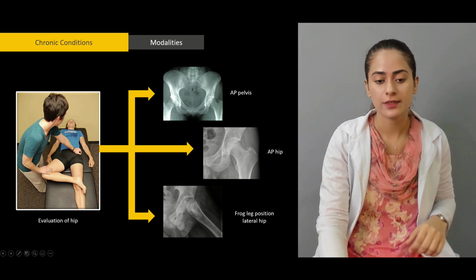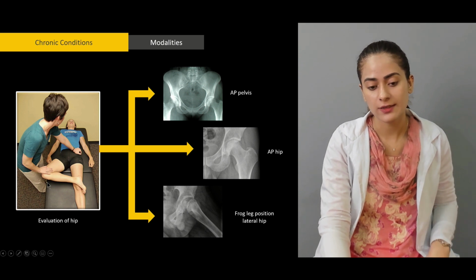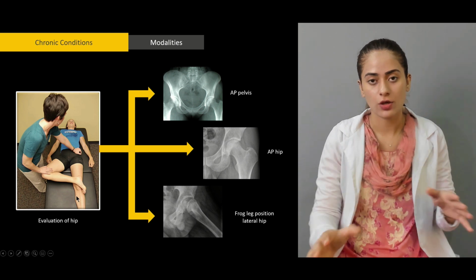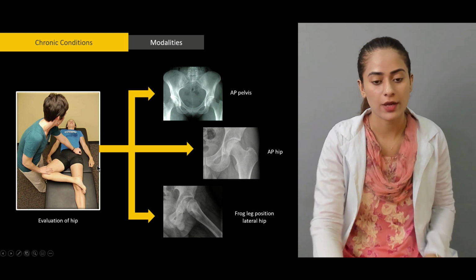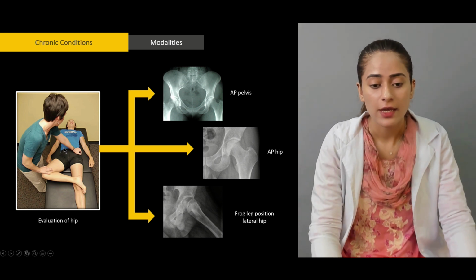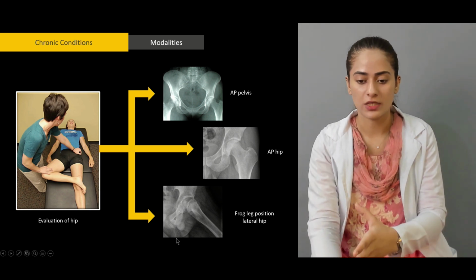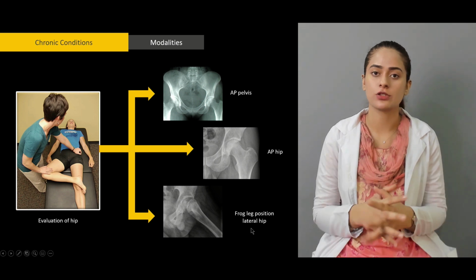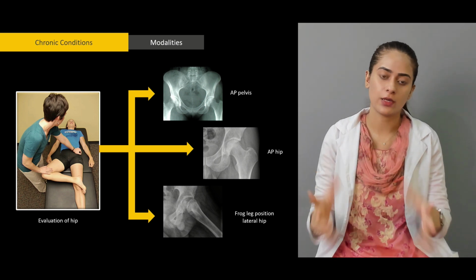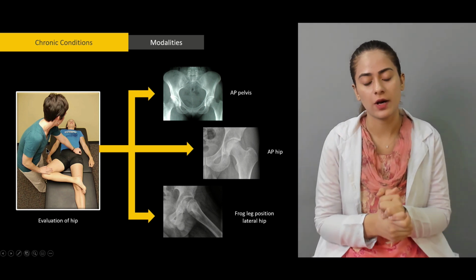And then you're placing like this. This is moved laterally. But then just imagine that this foot was here and the other foot was here, and both the knees were in opposite directions, right? So that was hook lying and then separated. And then if a radiograph was obtained, it would be something of this sort. So that is frog leg position, or the lateral hip, but it's obtained with the X-rays falling on the body at 90 degrees.